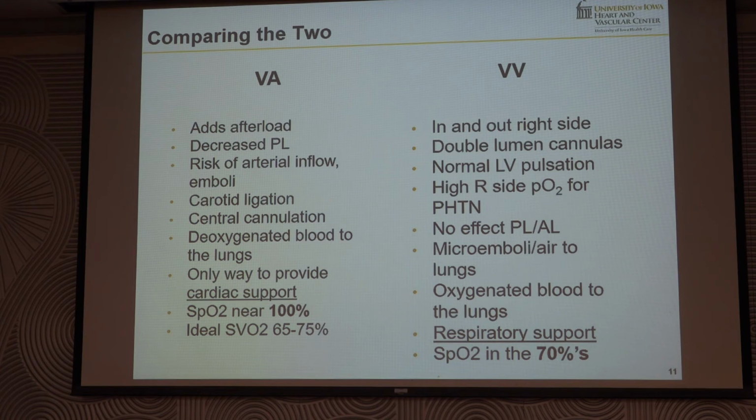It does not necessarily provide oxygenated blood to the lungs. It's something to consider. Since we're not oxygenating the blood directly to the right side of the heart, we're returning it back to the left side of the heart. Sometimes the lungs don't get the best oxygenated blood, and we'll discuss that a little bit later. But this is the only way we can provide cardiac support.